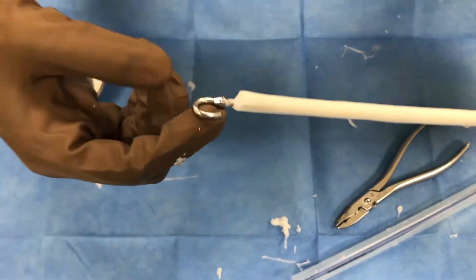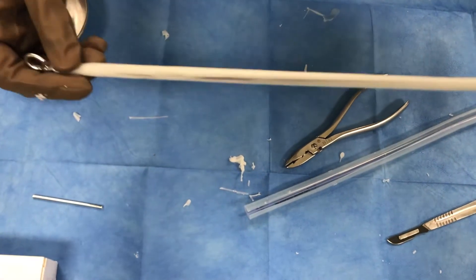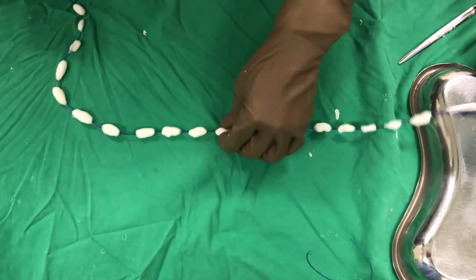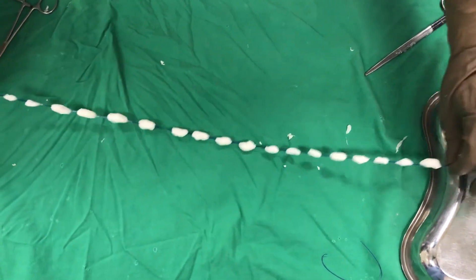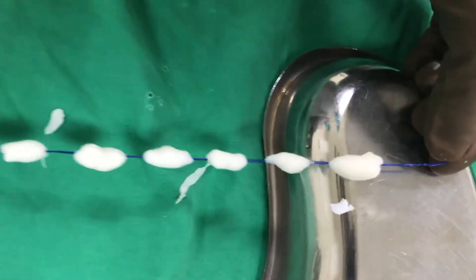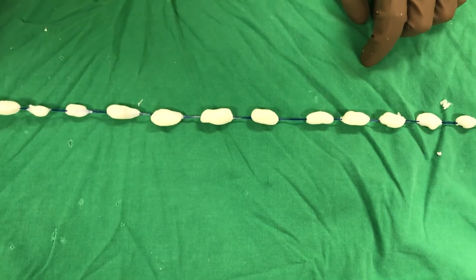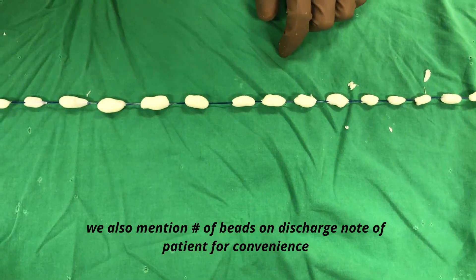This is the hook that we were talking about — it will be good to hook something in and take it out later. Now we can demonstrate the cement beads as well. These are ready; you can see they are firm and hard and can be inserted into the infected cavity. These are mounted with suture knots at the end. Make sure that whenever you are inserting cement beads you have counted the number of beads. If you do not remember, you might end up having to extract the beads and may leave some behind inside the cavity, which could lead to another surgery for no reason.